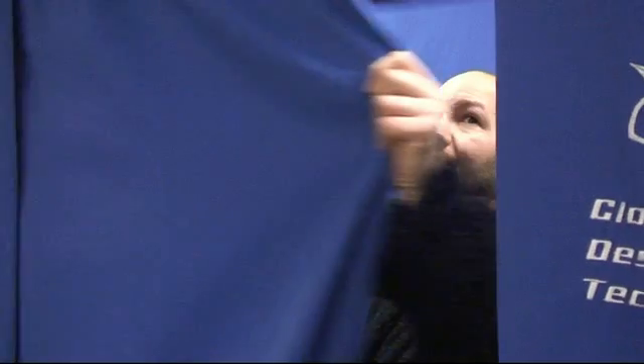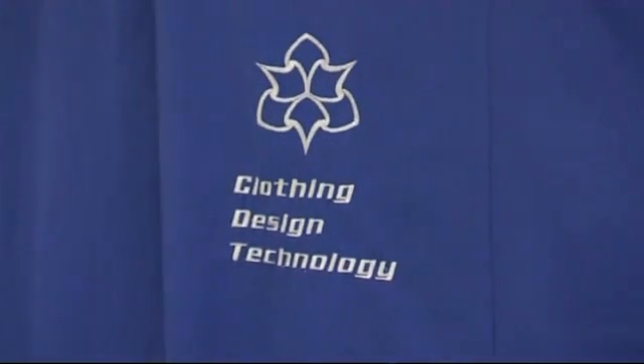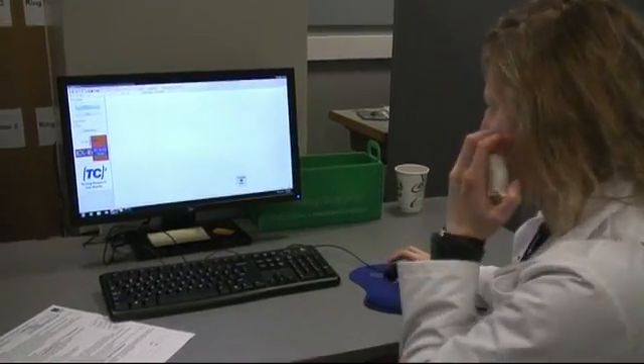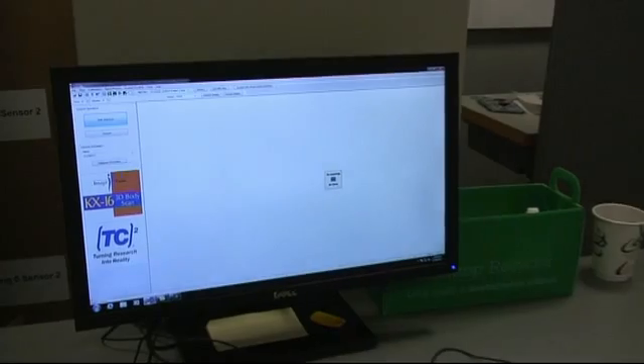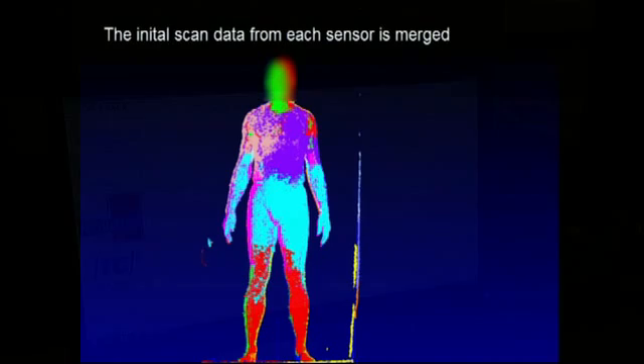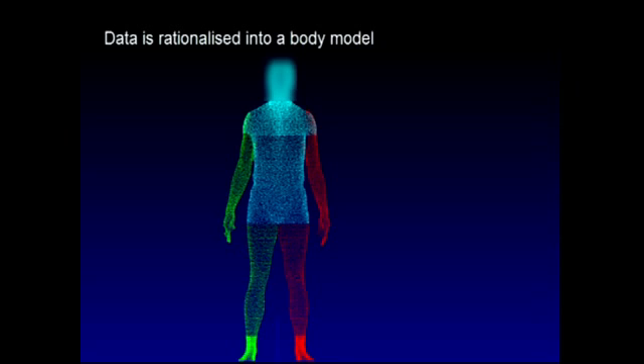The scan process then begins. The system prompts: 'Please be still. The body scanning process is starting. We have completed your scan with the latest in body scanning from TC Square. Please remain in the scanner while your body scan is processed.'